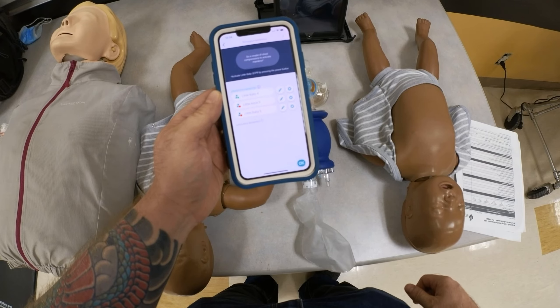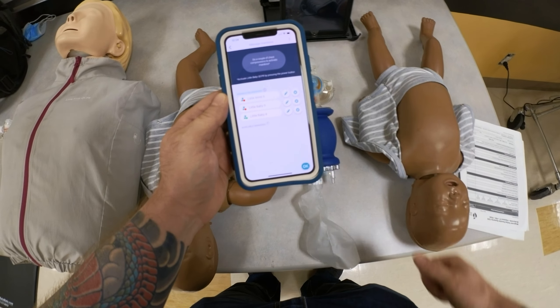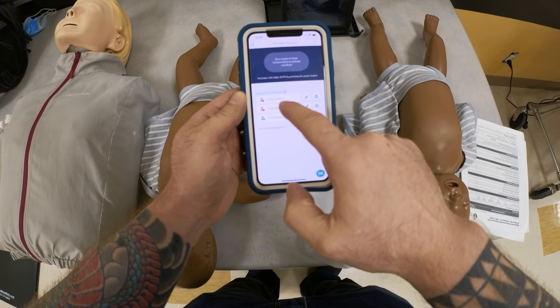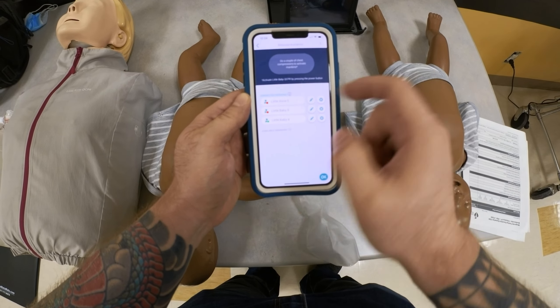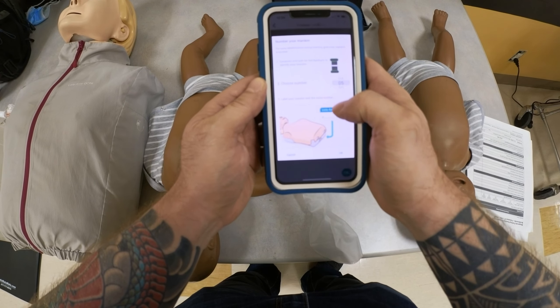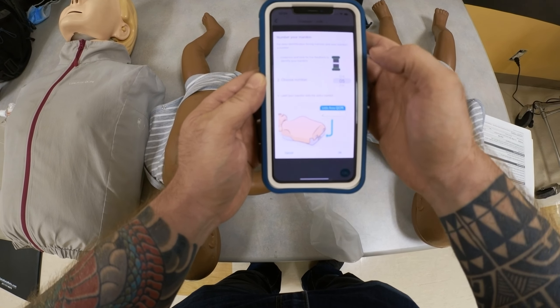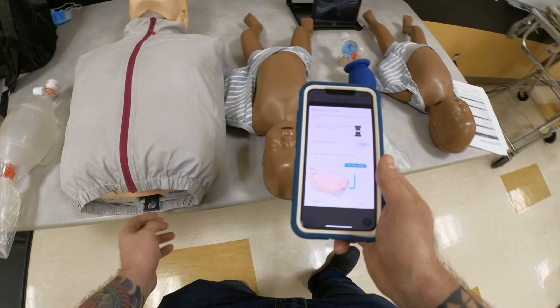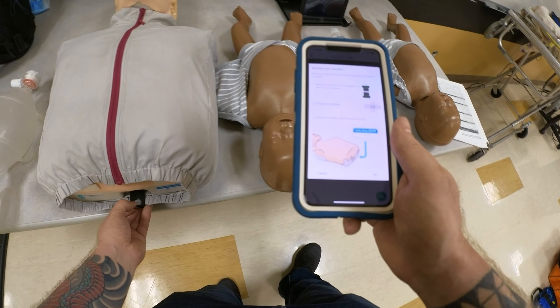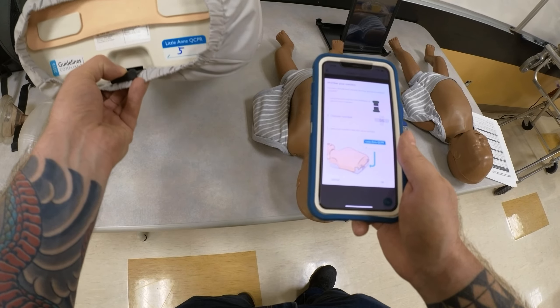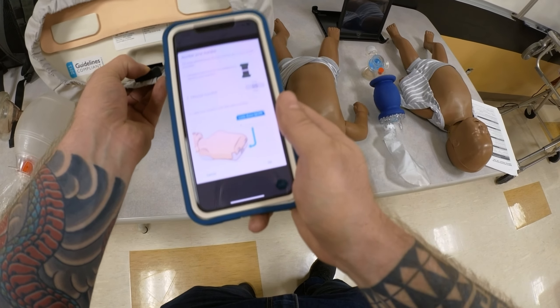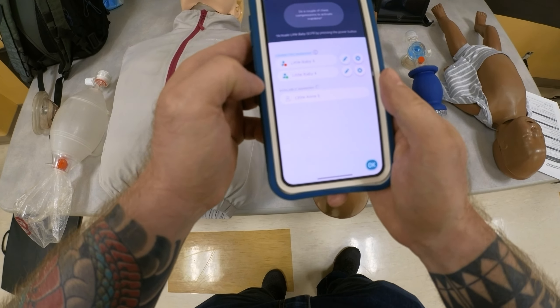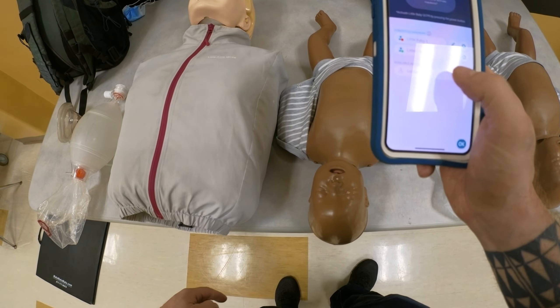You can have up to six mannequins on one app. Once they are paired, you can change the name and label them by the numbers at the bottom. So this one is number five — you enter five and it displays for you.